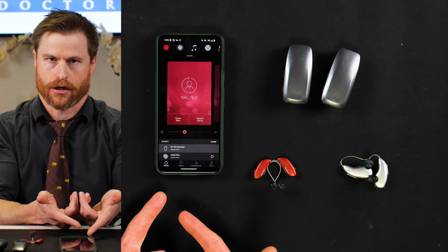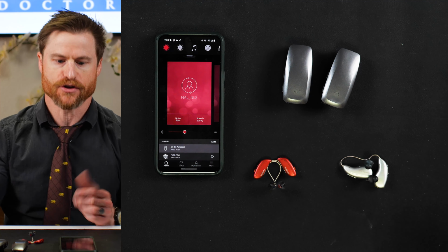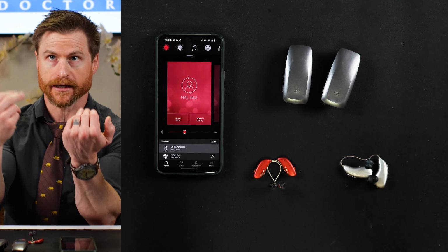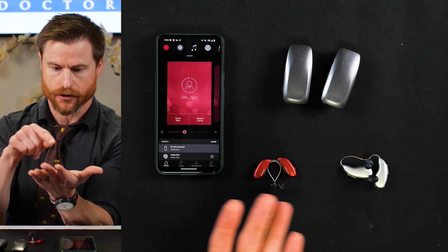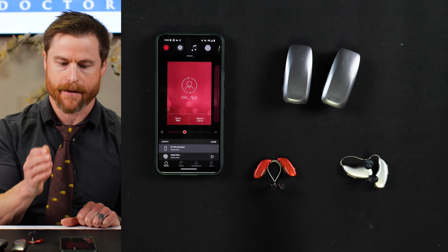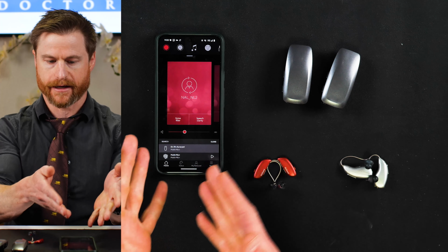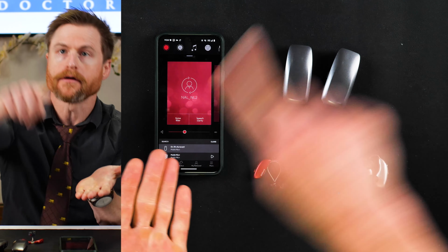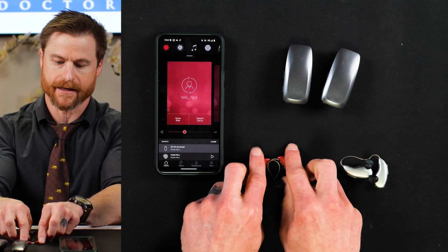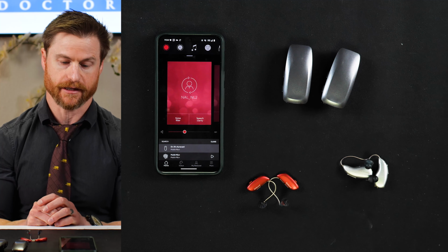This is cutting edge. If you go to a theater and they have a public Auracast stream, you can tap into that. You go to an airport and those TVs have a public Auracast stream that you can go through your Bluetooth menu and tap into. The ReSound app is like your intermediary remote, where you can access the public streams and send them into your hearing devices. That's been something I've been nerding out on within the past 3 weeks.